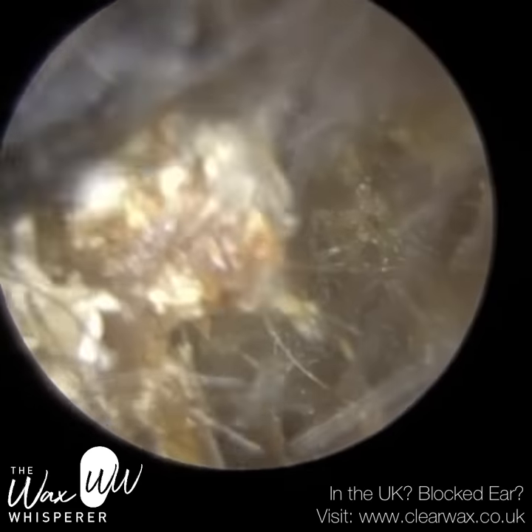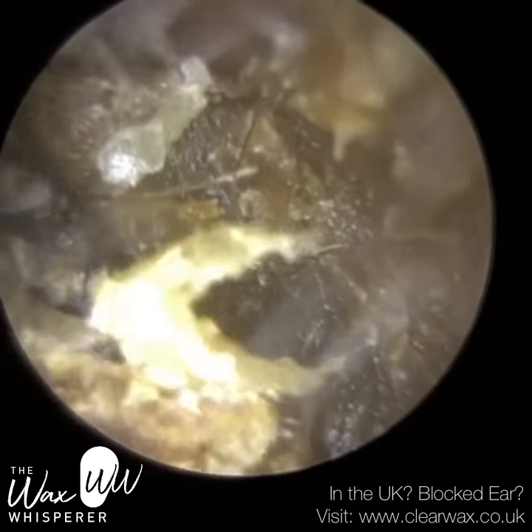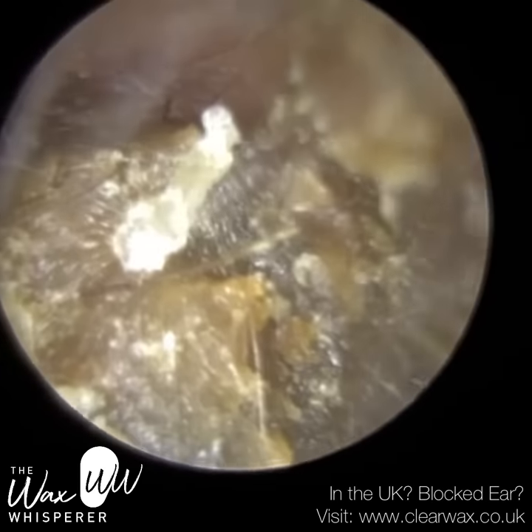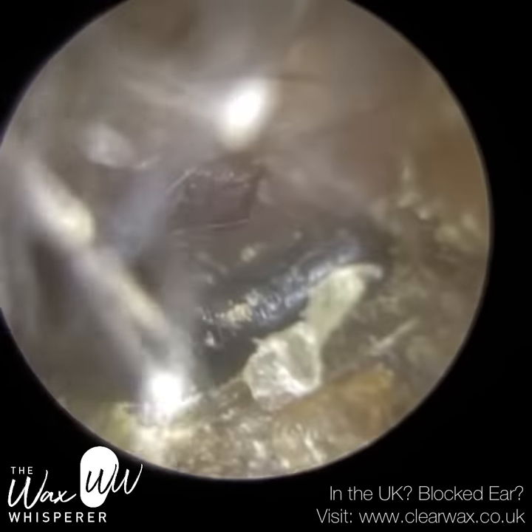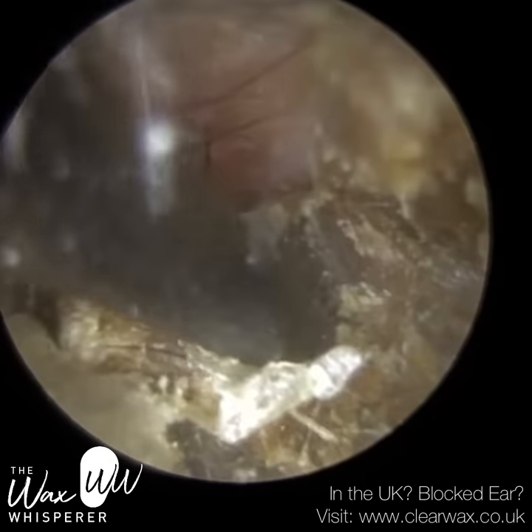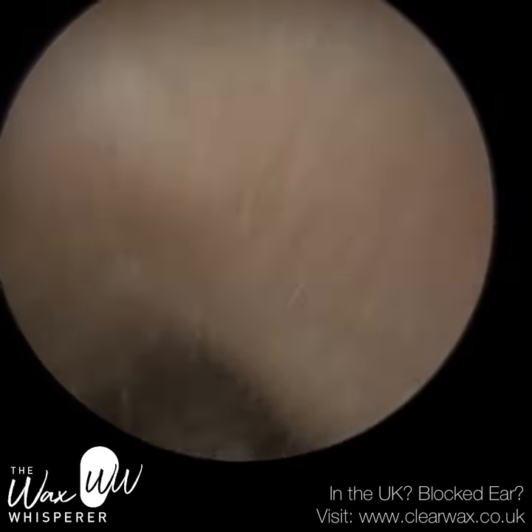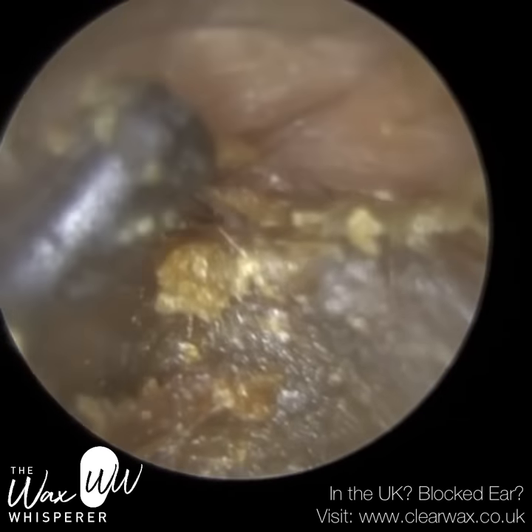Just going to the front part of the ear canal, trying to roll the wax forwards. Whenever we use the hook, we've got to be careful that as we extract it, the tip is not left dragging against the base of the ear canal or the side of the ear canal walls, because that will cut and abrade the ear canal. I have done that before — it's just part of the learning curve. During our clear wax training courses I make reference to that a few times, as it can be a bit uncomfortable for the patient.